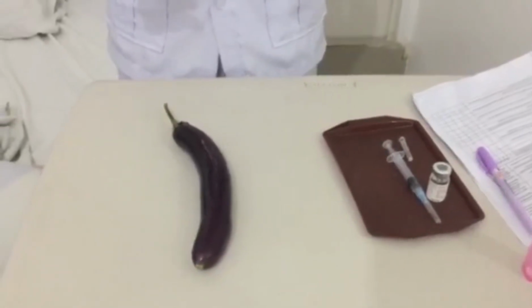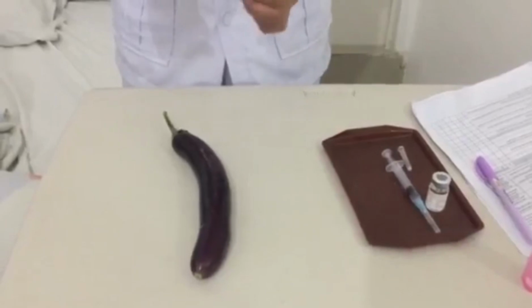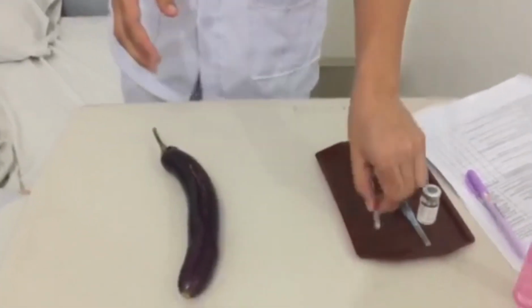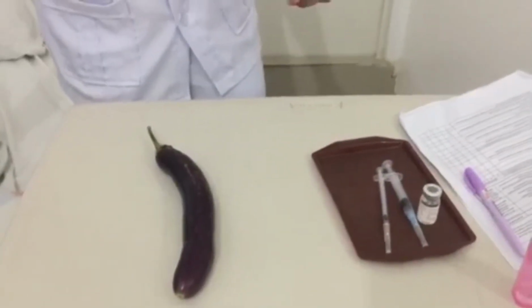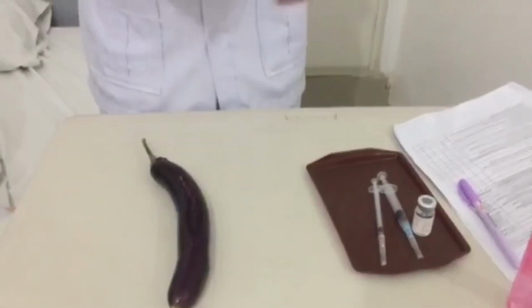Assist the patient into a comfortable position. Flip down the medication ticket if not using the MAR. Reminder: there is no blood, as you can see when I inject the medication. So I will inject it directly.